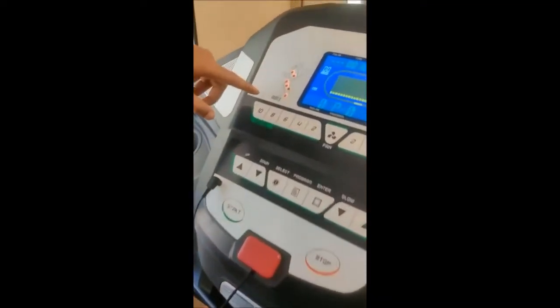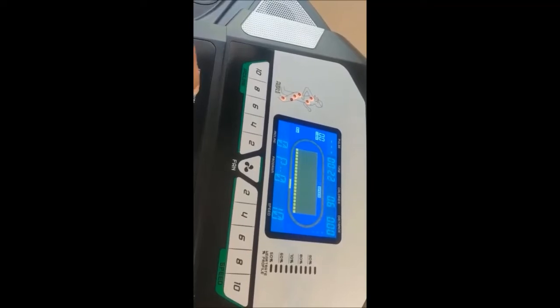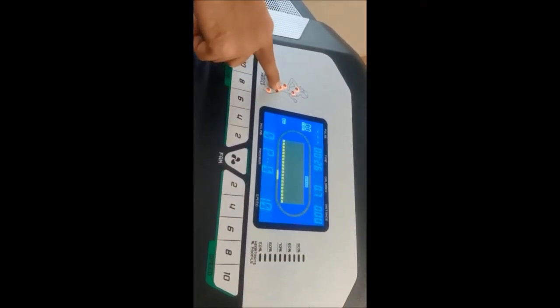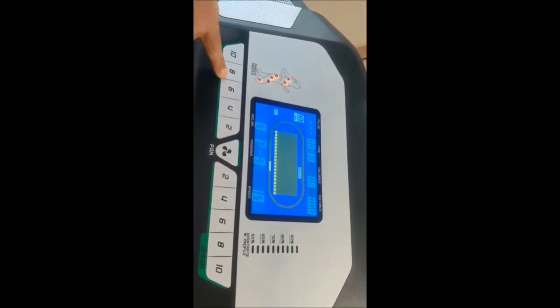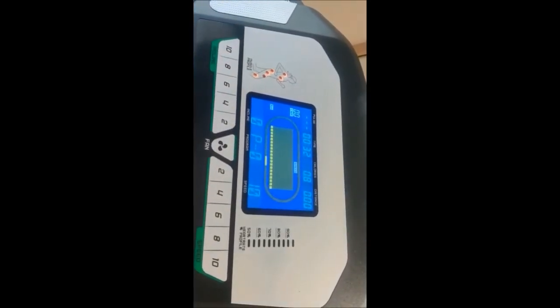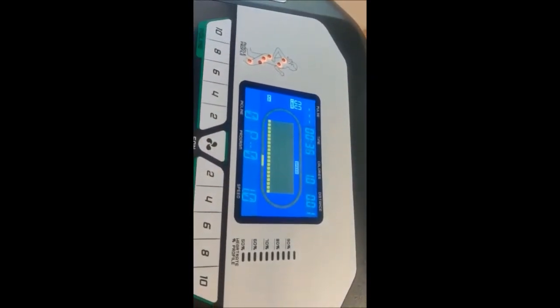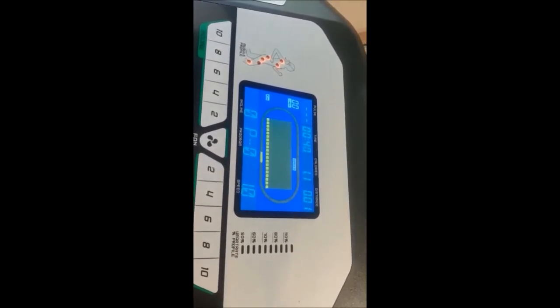On the treadmill, if the machine is in normal position, only a few LEDs are active, meaning this is a standard flat exercise. When the height increases in incline position, additional LEDs are also lit, indicating that the upper body part of the exercise is also engaged.